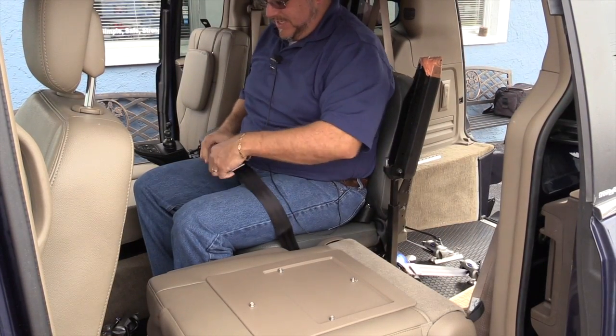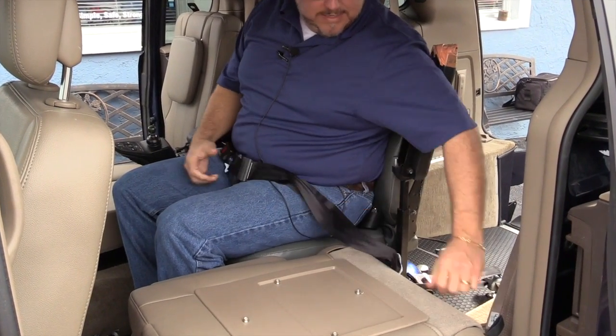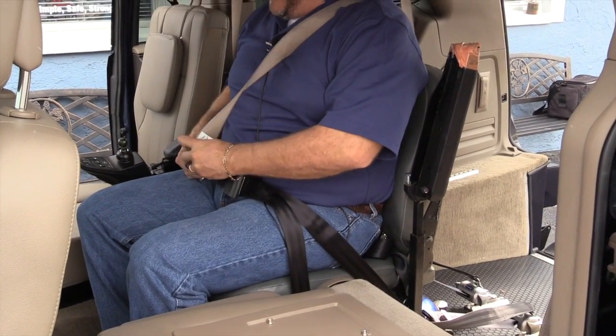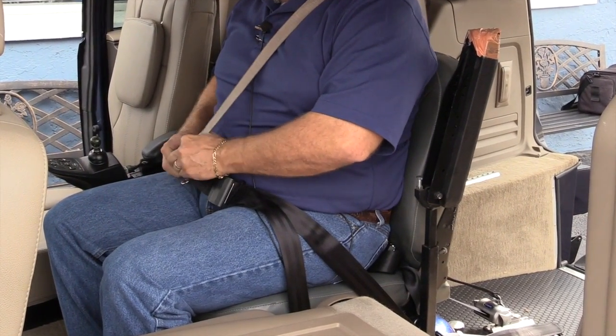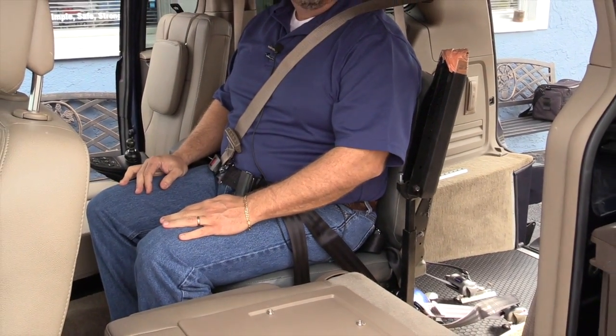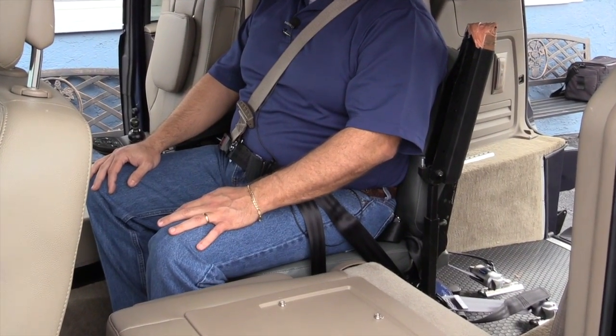You can buckle the seat belt, and then you can hook up the integrated shoulder harness to give you three-point protection. Here at Triple S Mobility, we want to make sure your loved ones are safe when you take them for a ride.